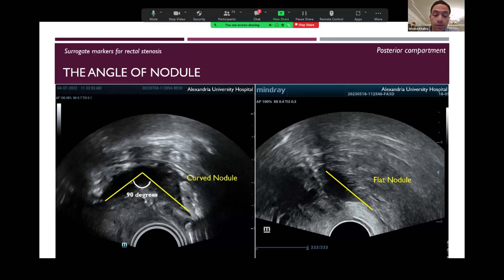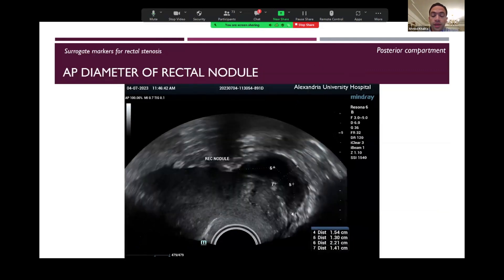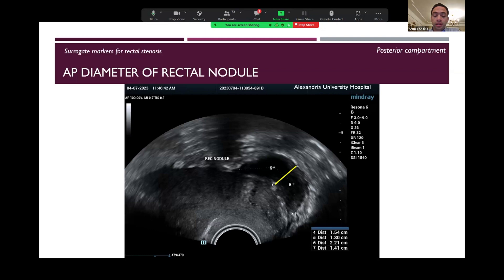There are markers for rectal stenosis. First, the angle of the nodule: a curved nodule of about 90 degrees increases the suspicion of rectal stenosis, while a flat nodule is associated with lower suspicion. Second, the circumference: checking the transverse diameter of the rectal nodule compared with the rectal lumen — if the rectal lumen is less than 50% of the diameter of the rectal nodule, we suspect rectal stenosis. Third, the anteroposterior diameter of the rectal nodule — the depth of the lesion into the rectal wall — where more than 7 millimeters to 1 centimeter is the cutoff point for suspicion of rectal lumen stenosis.